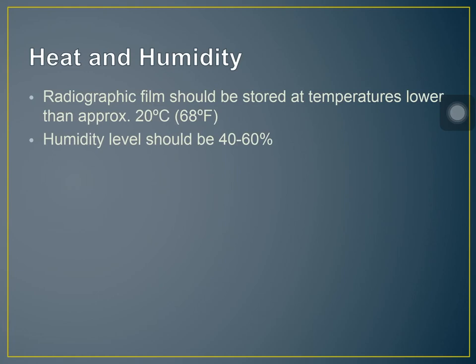And that static artifact is smudge. When it comes to handling static artifact, that is smudge. Yung bigla ang pagbunot, nagkaroon ng friction with each other dun sa kanyang mga kasamahan na film sa loob ng box. That is smudge artifact.